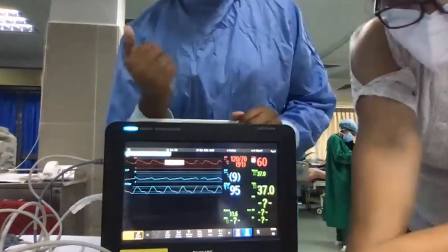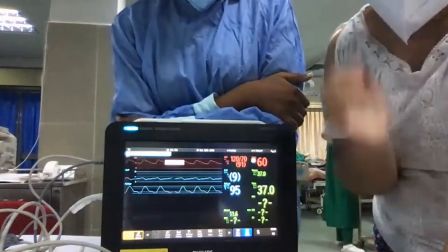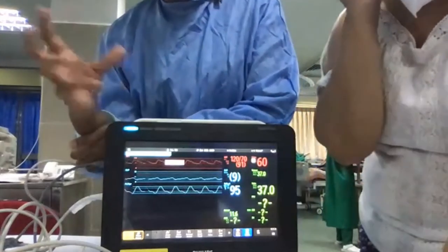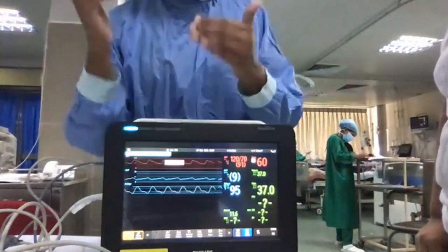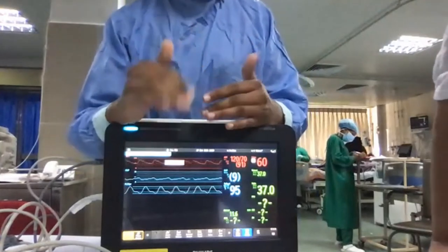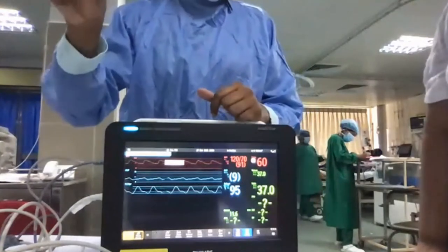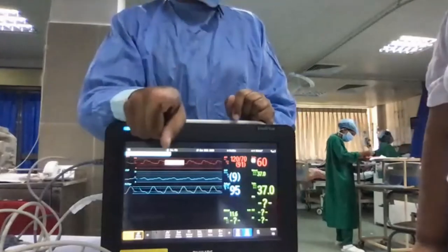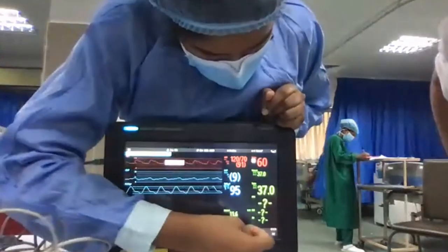That is all that we wanted to demonstrate. And I forgot to tell one thing, madam. Say the hemodynamic condition of the patient drastically changed, like it was said in the video. You need to do a recalibration every 8 hours, once in 8 hours you have to do it again. And in the middle, if you feel the cardiac output value displayed on the monitor should change, what you can do is go to cardiac output again.